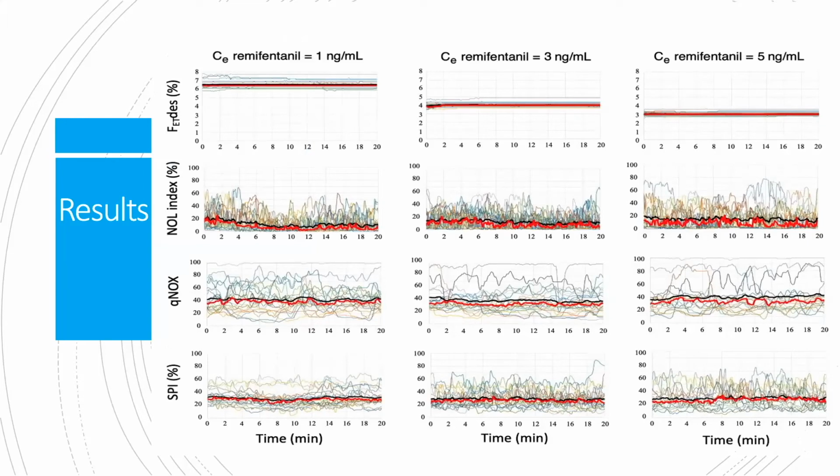All in all, we had with the 3 different nociception monitors, according to the manufacturer's instructions, adequate levels of nociception in all 3 legs. There was a small problem with some unexplainably high qNOX values, but according to the communication we had with the manufacturer, that was because our monitor was running on an older software version. So this should not be a problem anymore.